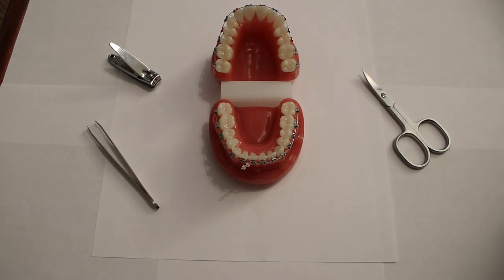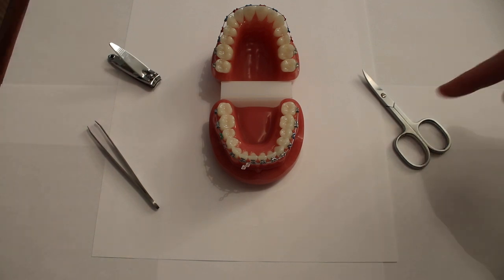I have checked and it is possible to simply cut the elastic power chain as short as is required, either with some nail clippers or nail scissors.